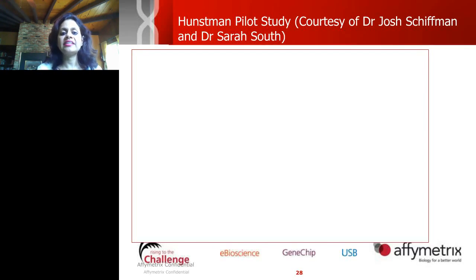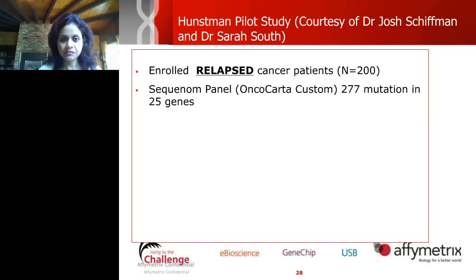So now I want to highlight a Huntsman Cancer Institute study, courtesy of Dr. Josh Schiffman, an oncologist at the Huntsman Cancer Institute, and Dr. Sarah South, lab director at ARUP. This was a study that enrolled relapsed cancer patients, which would be the category to first address, because oncologists typically are willing to go off protocol for these patients because their prognosis is so poor.